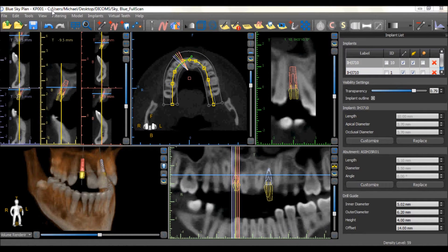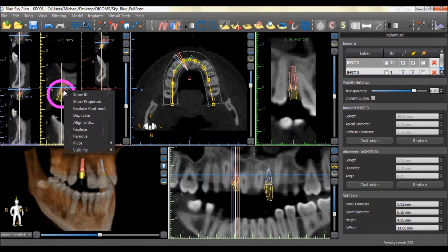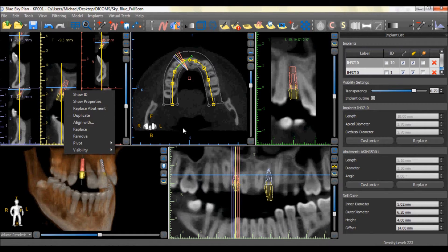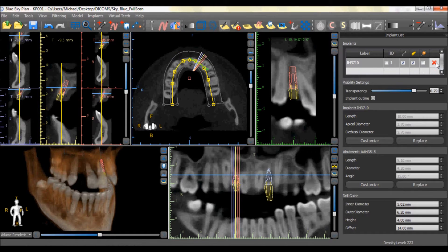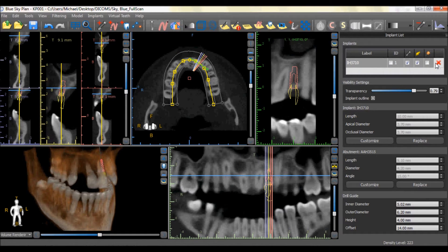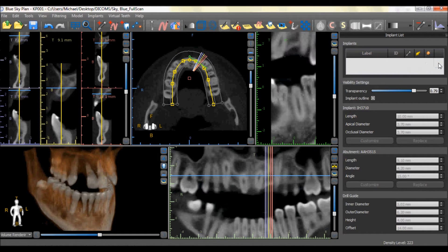An implant can be deleted by right-clicking on the implant and choosing the Remove option, or by pressing the red X to the right of the implant in the Implant Properties panel.